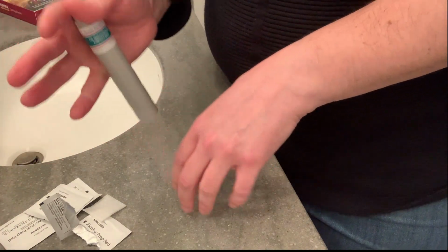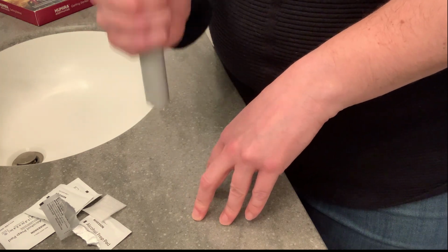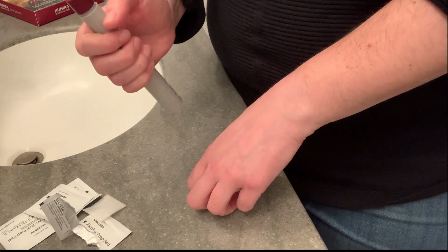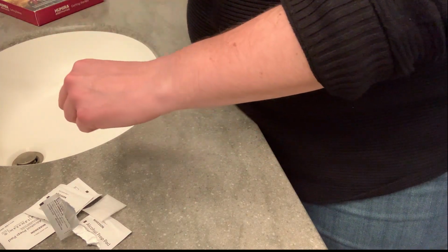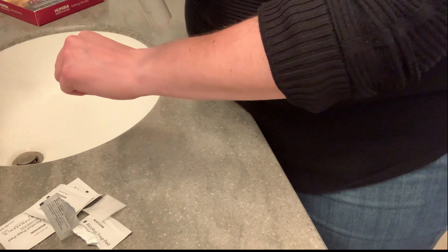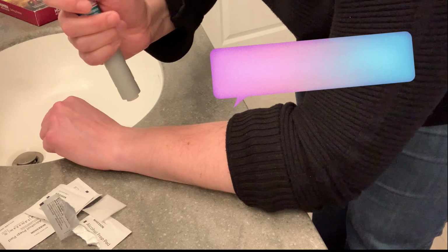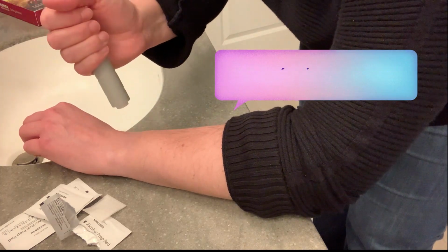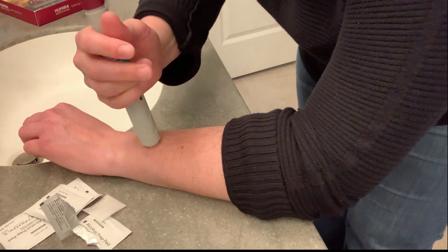So what you want to do is hold the pen almost like you're going to stab something. You want to keep your thumb away from the trigger until the last minute. You'll have to squeeze the skin and then basically at a 90-degree angle just press down. Obviously, I can't do everything at the same time because I'm using my arm, but you get it. So 90-degree angle.